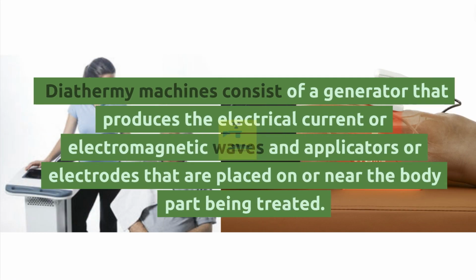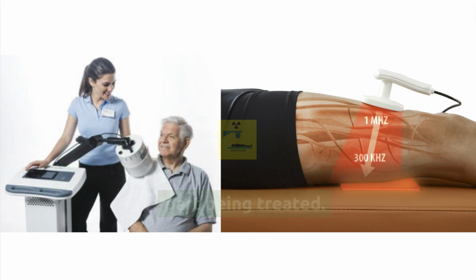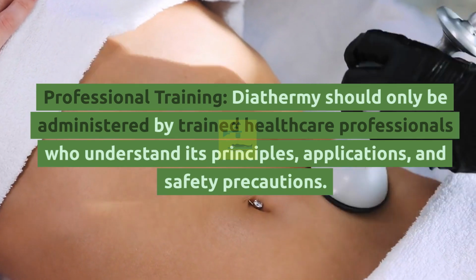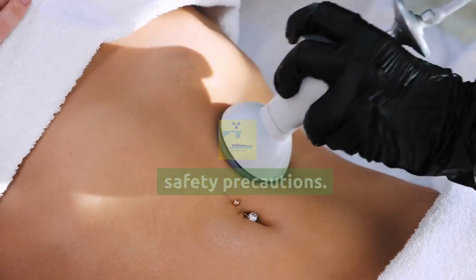Equipment. Diathermy machines consist of a generator that produces the electrical current or electromagnetic waves and applicators or electrodes that are placed on or near the body part being treated. Professional training. Diathermy should only be administered by trained healthcare professionals who understand its principles, applications, and safety precautions.